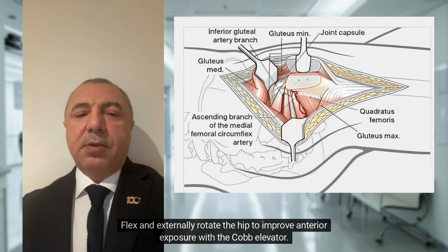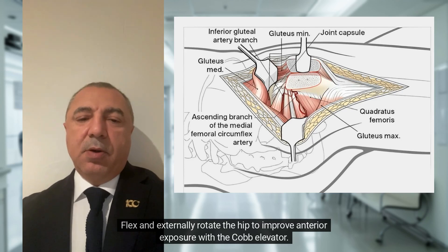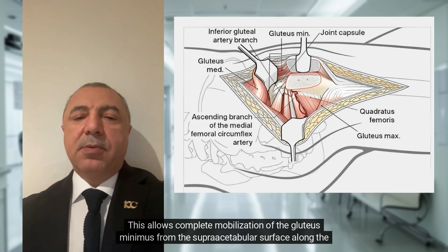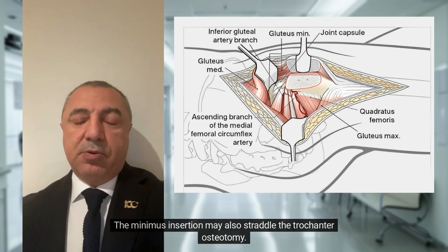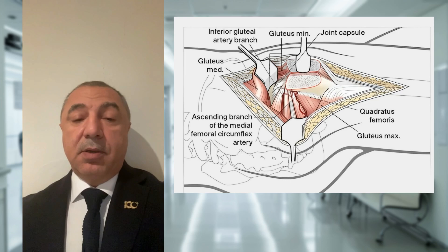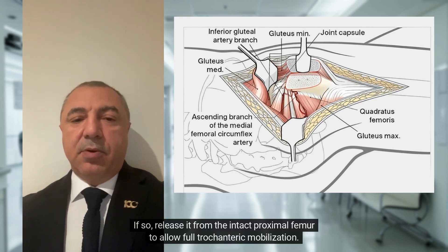Flex and externally rotate the hip to improve anterior exposure with the Cobb elevator. This allows complete mobilization of the gluteus minimus from the supra-acetabular surface along the superior capsule to its femoral insertion along the anterior aspect of the trochanter. The minimus insertion may also straddle the trochanter osteotomy. If so, release it from the intact proximal femur to allow full trochanteric mobilization.